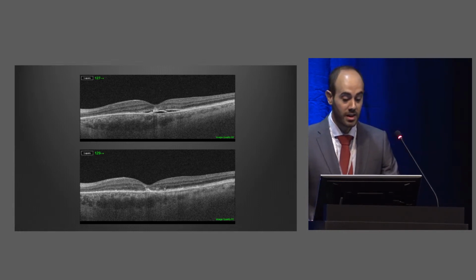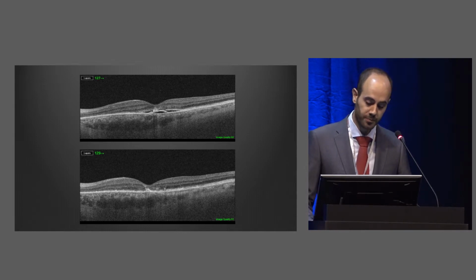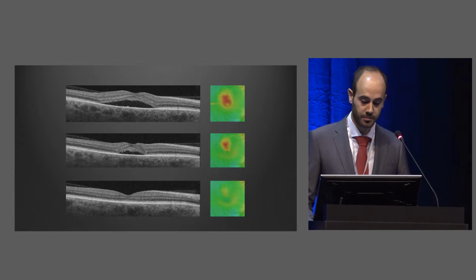One more case. This is the eye of a general practitioner in my area. He had been around for years with all sorts of treatments, also all sorts of diagnoses. You can see there's quite a big alteration of the external retina. One session, one session and we achieved resolution of the retinal fluid. Of course, vision doesn't improve, look at how the outer retina is, but at least the paracentral scotoma remains stabilized.